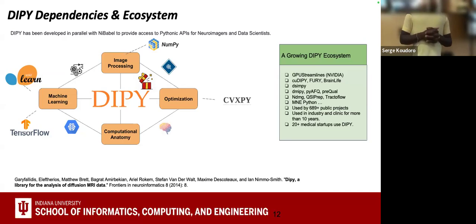So this project is built in parallel with Nibabel. Nibabel and DIPY are very close. They were really created at the same time. We try to interact a lot, and some stuff moves from DIPY to Nibabel, et cetera, et cetera.